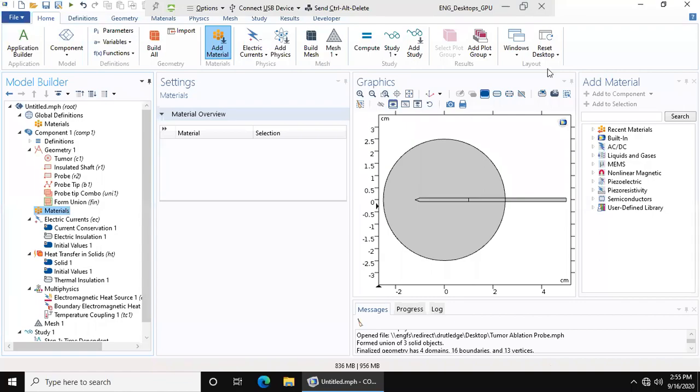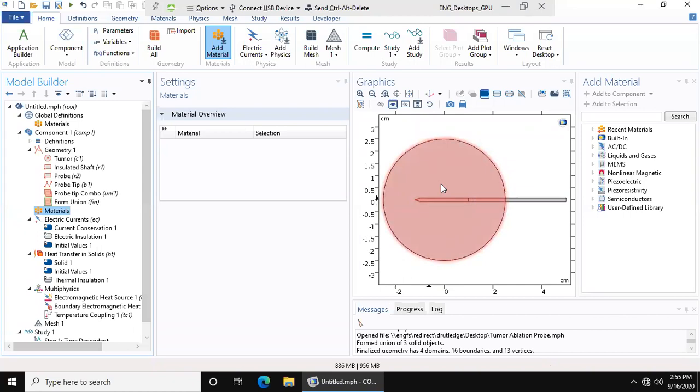Welcome back to the COMSOL Tumor Ablation Probe module tutorial. In this video, we're going to be adding materials. Last video we did our geometries, and now we want to add materials to these geometries to give them properties so that our physics will make sense of it.